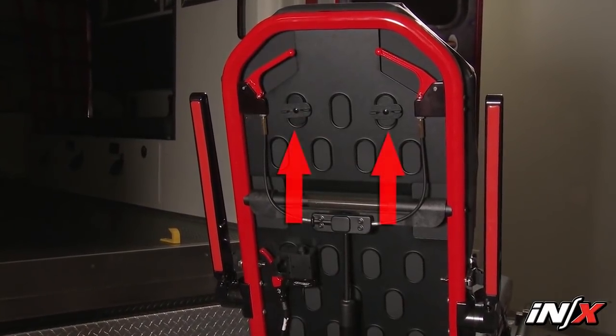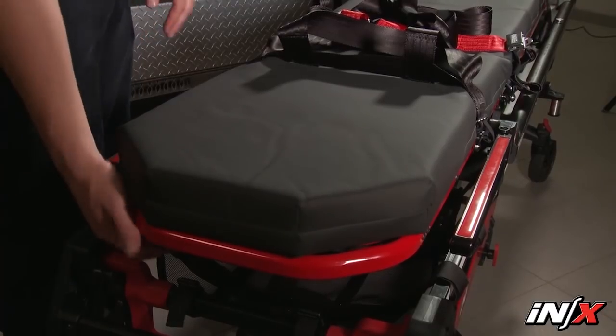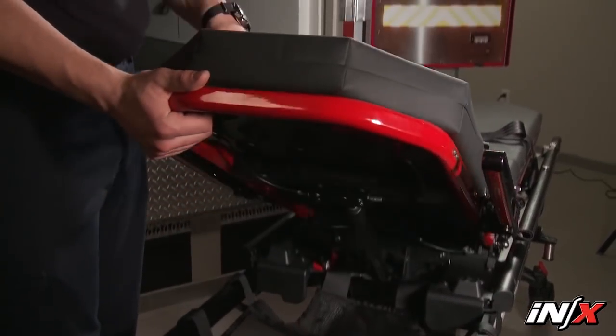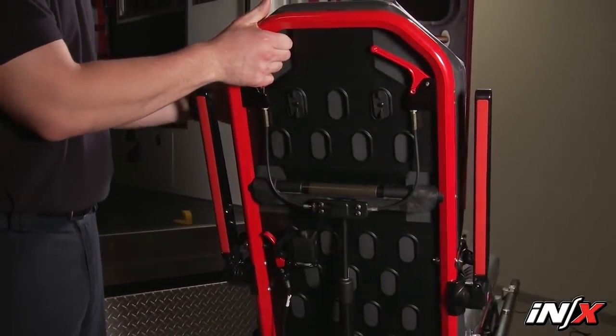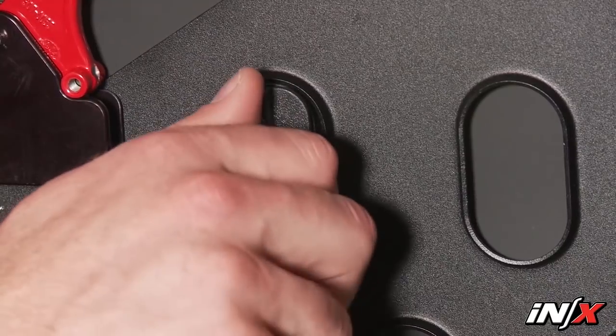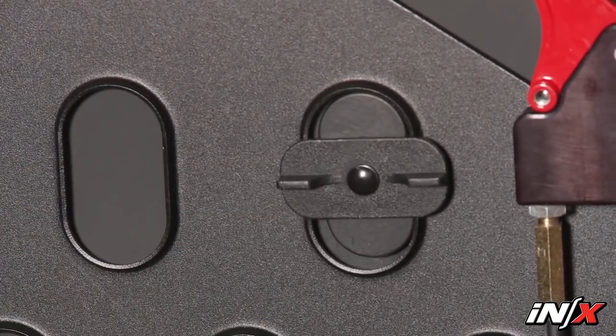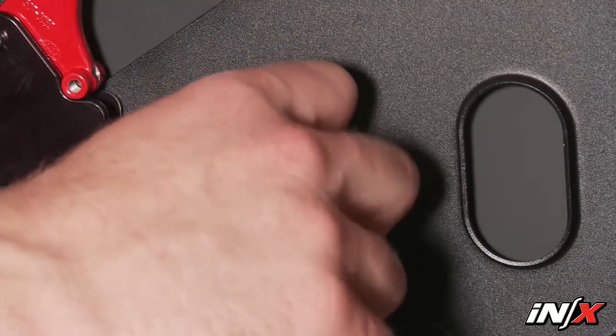The pad is fitted with eight locking discs that secure it to the patient's surface. Position the pad on the patient's surface and raise the backrest and shock frame as needed. Press down on the center of the pad to guide the locking discs through the seat panel. Twist the discs 90 degrees in either direction to lock them in place. Reverse the process to remove the pad.